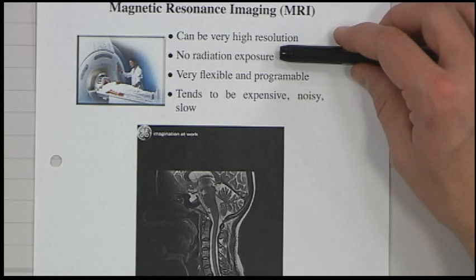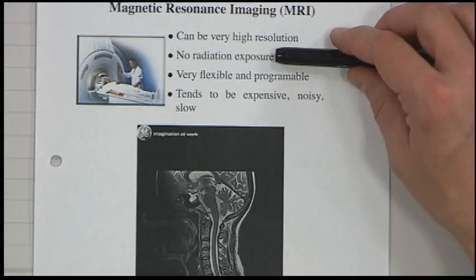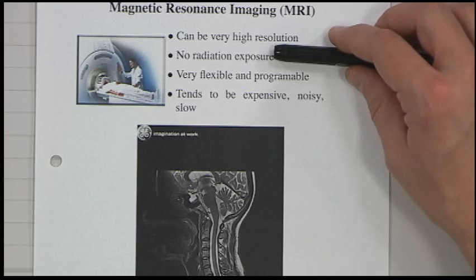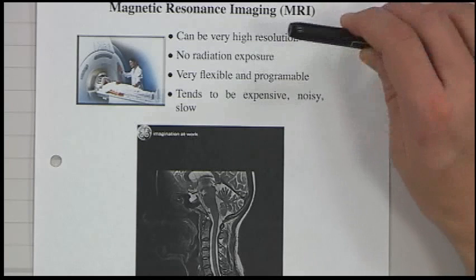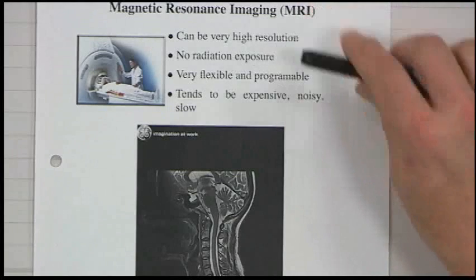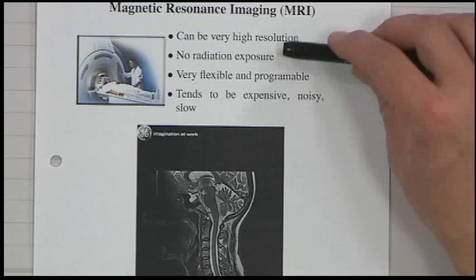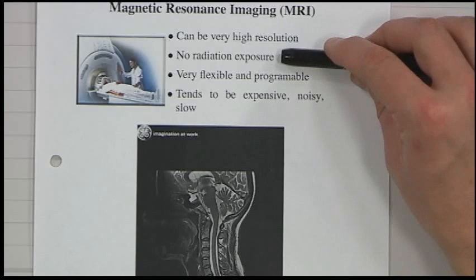It's just RF signals, which there's a little bit of controversy about. RF signals definitely have some health issues, but in general, I think it's widely accepted, and I certainly strongly believe, that they don't cause cancer. Some people talk about cell phones causing cancer. I just don't buy it. I think it's silly, frankly. But don't quote me on that because I'm not a health professional, so the FDA can't come and get mad at me. But I don't believe it. So there's no ionizing exposure.